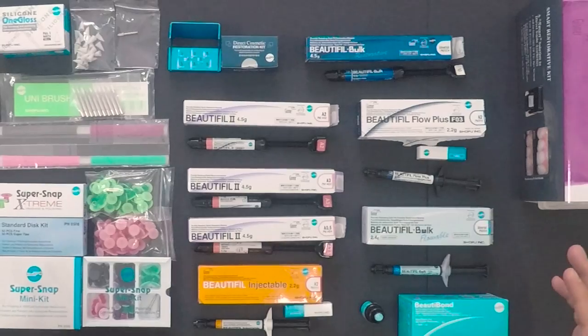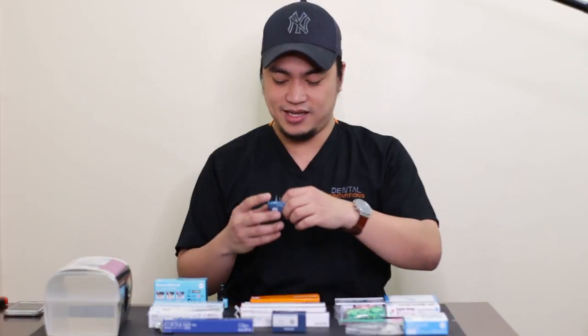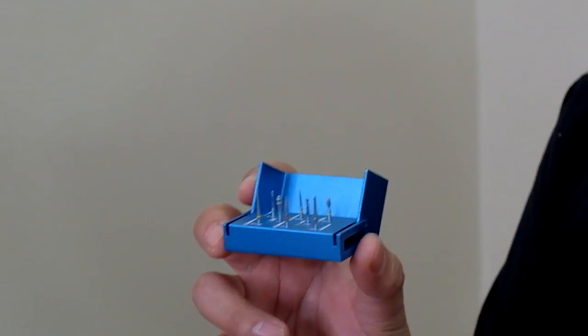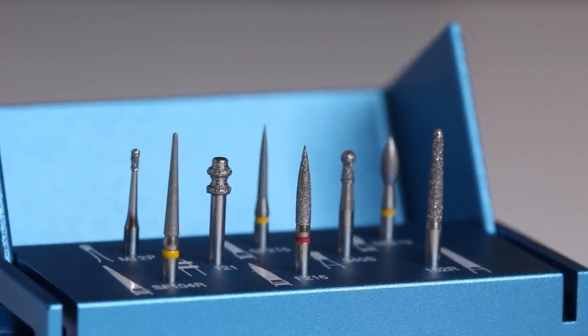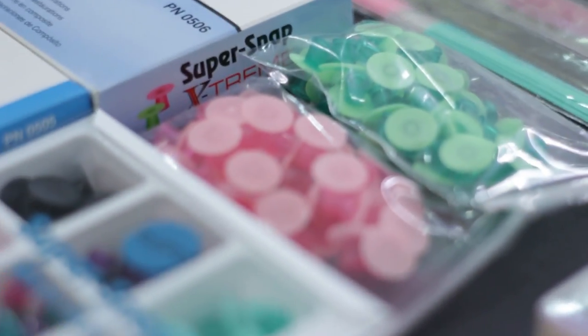Now that I have everything out, my desk is filled. There's so many things. This is definitely worth it. My favorite part about this kit is the burrs — they're great. I love doing anterior aesthetics and anterior restorations, and the burrs in this kit are perfect for that. Everything you need is right here. Looking at the spread, it's like being a kid at a candy store.